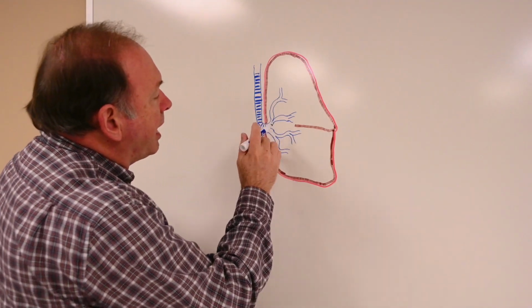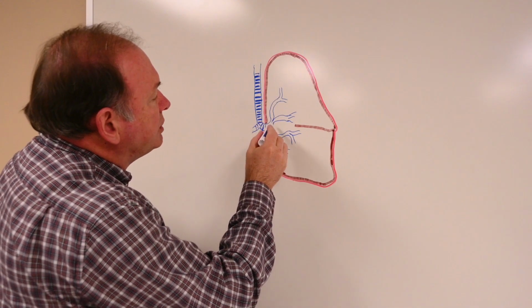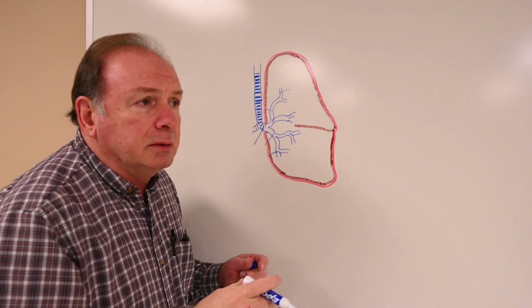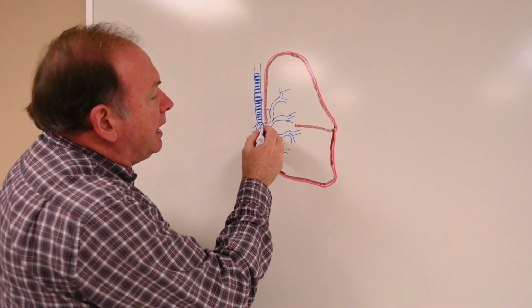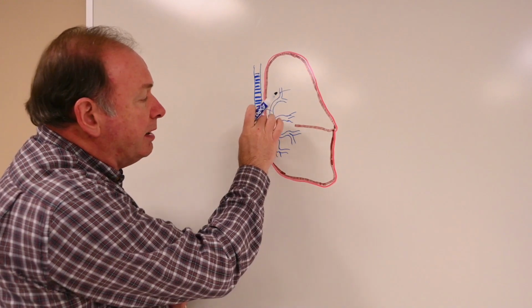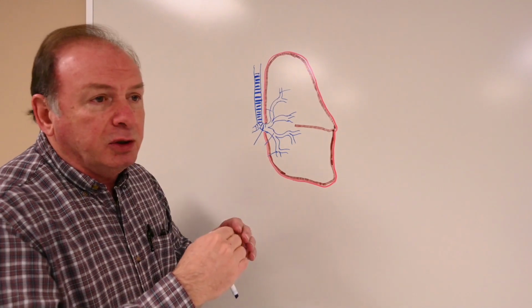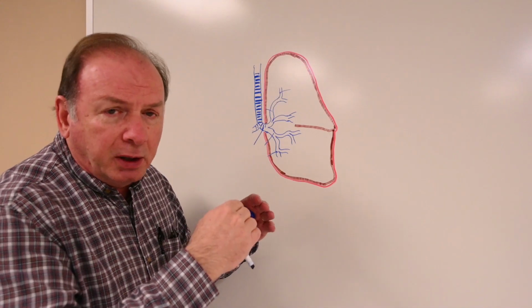So we have what's called a primary bronchus here, then there are the secondary bronchi that branch out in here, and then finally these tertiary bronchi out toward the ends. Those vary just a little bit in size. They get smaller as they go down. And the layering that we have in the trachea breaks down as we go into the lung. So we don't have a continuous submucosal layer or a continuous cartilage, smooth muscle layer. Those mix up a little bit.